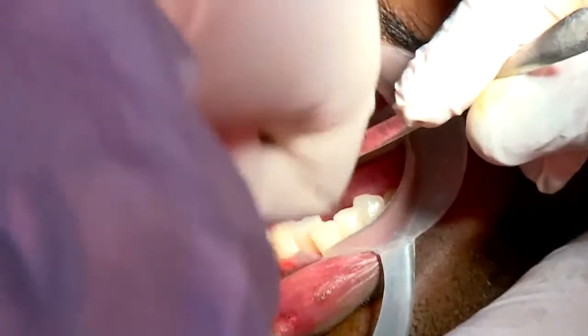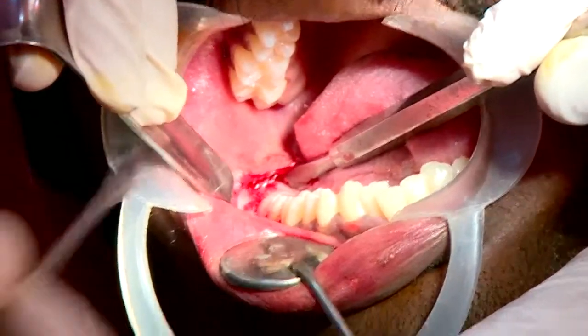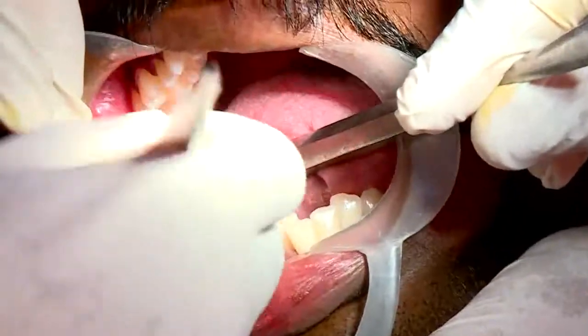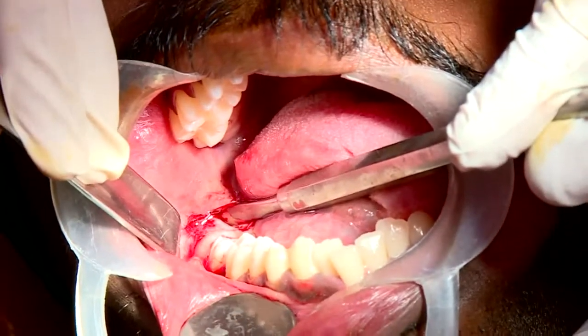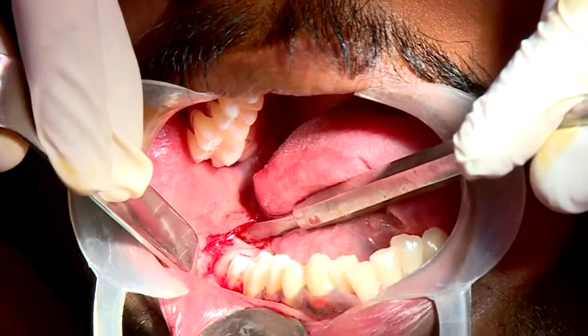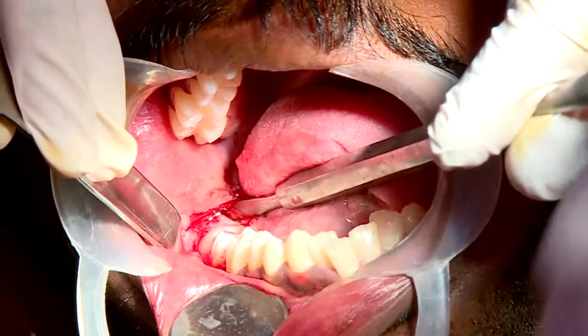Sir will be creating a trough. Usually a 701 tapered fissure burr is used. You can also use a round burr; books even tell us you can use a round burr. We have to remove bone and expose the tooth. Here sir is going to use usually a 701, 702 or 703 burr, depending on the size.